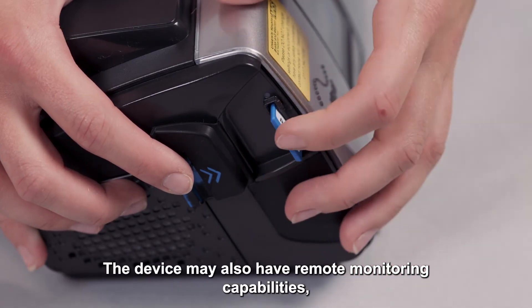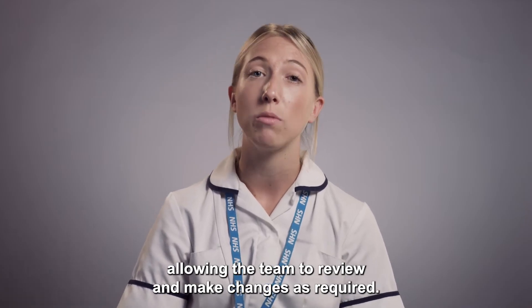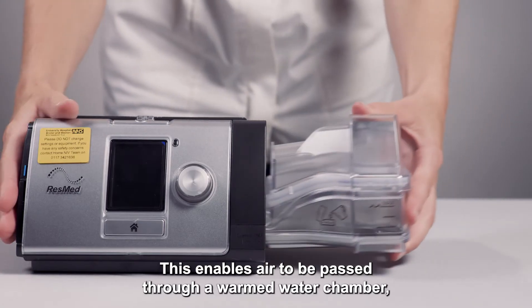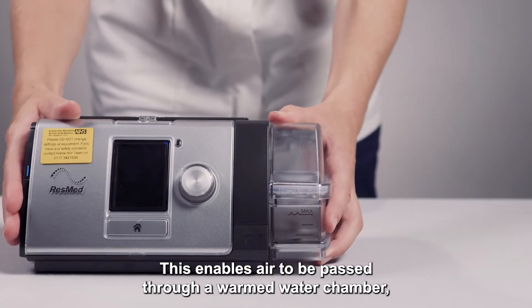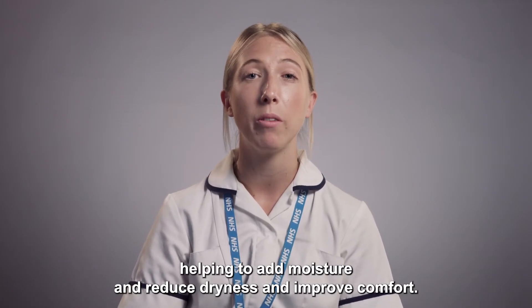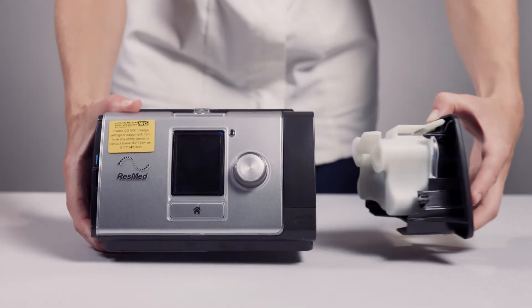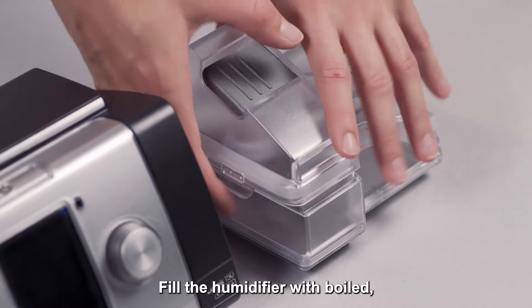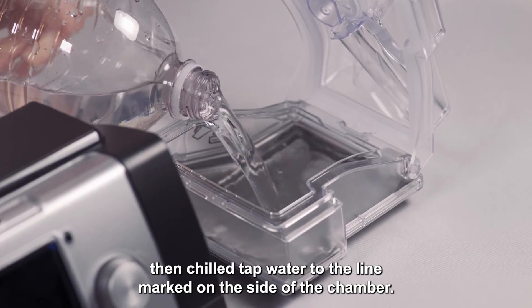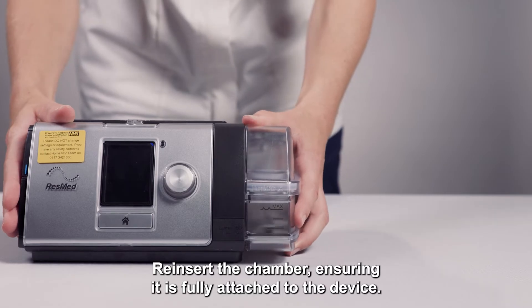The device may also have remote monitoring capabilities, allowing the team to review and make changes as required. A humidifier may be added to the device. This enables air to be passed through a warmed water chamber, helping to add moisture, reduce dryness, and improve comfort. To attach the humidifier, remove the side panel. Fill the humidifier with boiled then chilled tap water to the line marked on the side of the chamber. Reinsert the chamber, ensuring it is fully attached to the device.